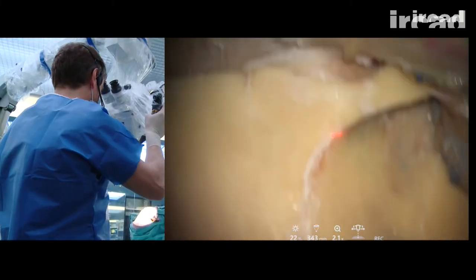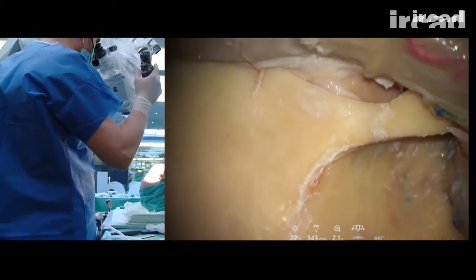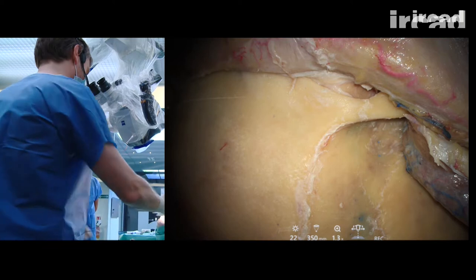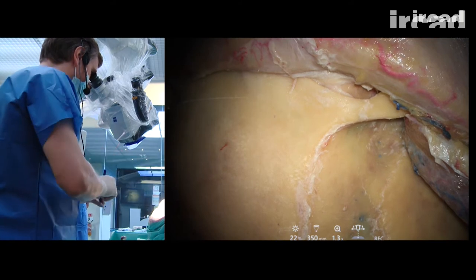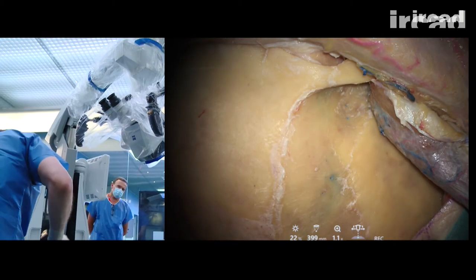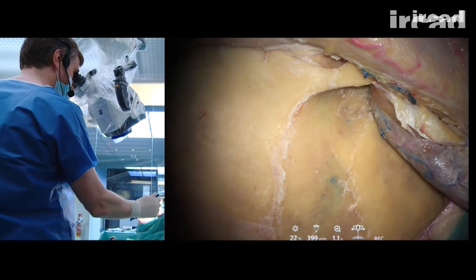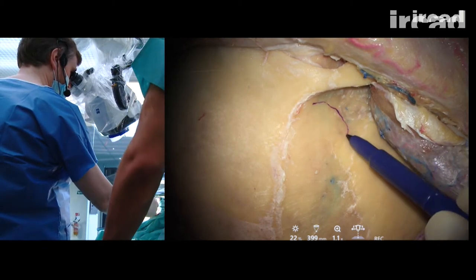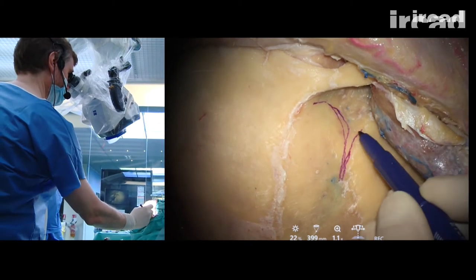So now the first burr hole should be the McCarty keyhole. In order to do the McCarty keyhole, it's important to envision the position of the sphenoid ridge. You can feel here a kind of gutter. So this will be the position of the sphenoid ridge.